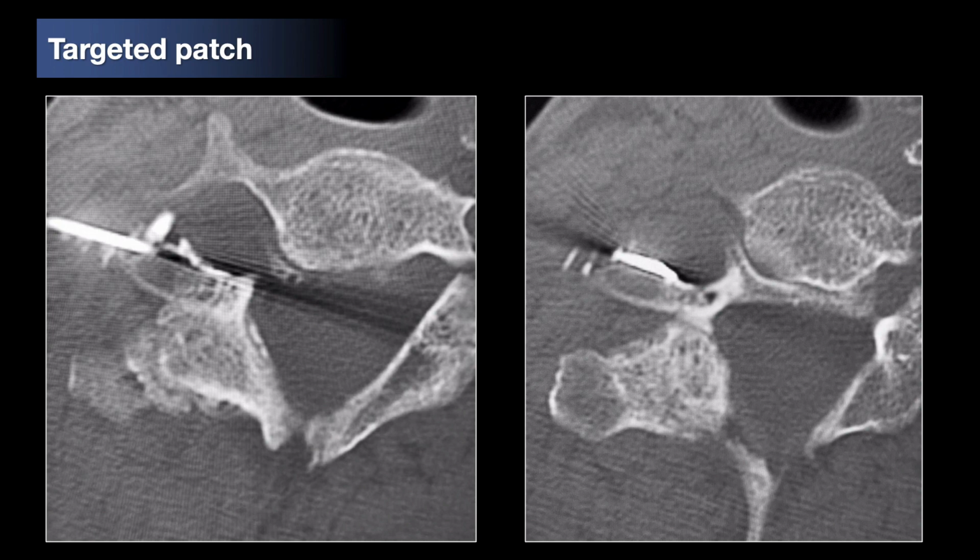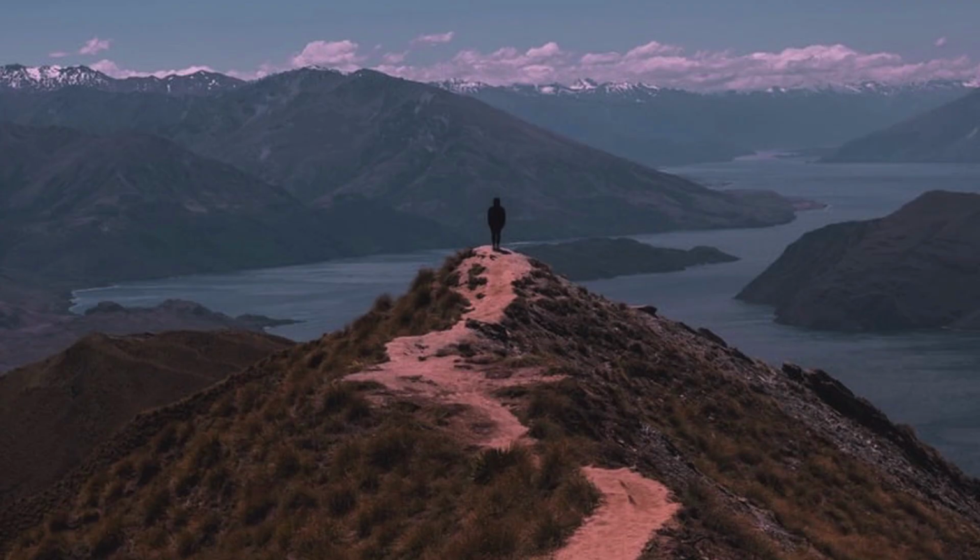So I did a fibrin glue injection. Here you can see it located extra-diverticular, around that diverticulum, and she made a cognitive improvement which was pretty successful for around a week, and then she deteriorated again. So eventually she had to go for tying off of that large diverticulum, and that cured her. She had a really long inpatient journey, and you can see from this critical case the pivotal role of the radiologist in making the diagnosis, the initial management, investigating her leak, and further treatment. She had such a long admission, but we eventually got there, and the outcome was cure. And we are nearly at the end of our own CSF leak journey.